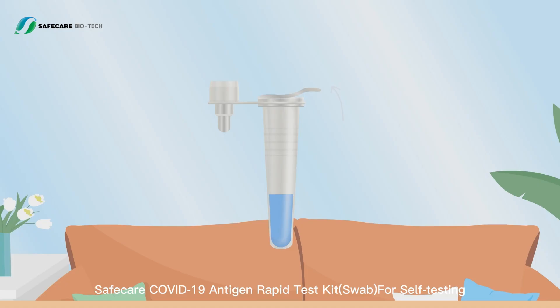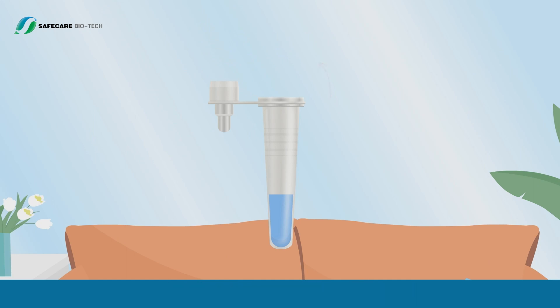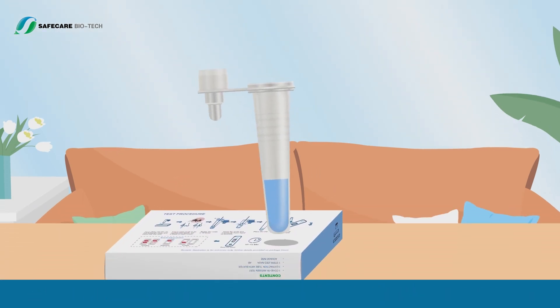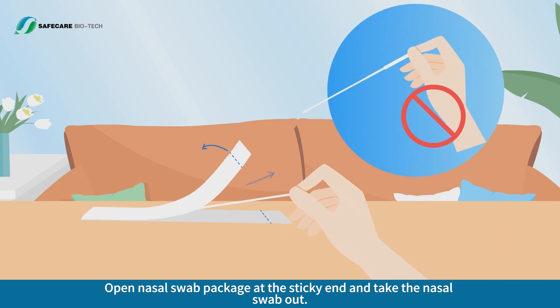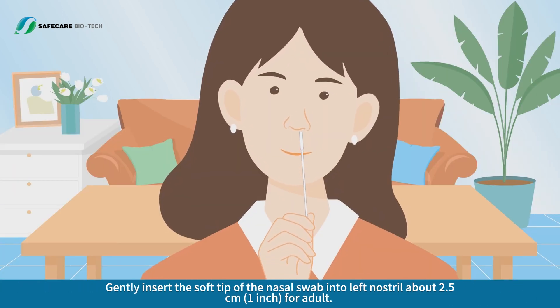Specimen Preparation: press the hole on the box. Peel off the foil film on the extraction tube and insert it into the hole of the workstation or box. Open the nasal swab package at the sticky end and take the nasal swab out.